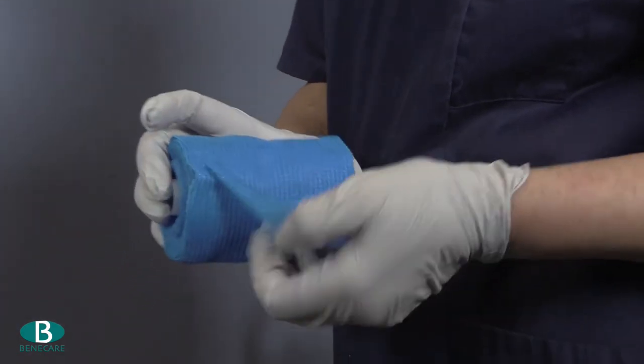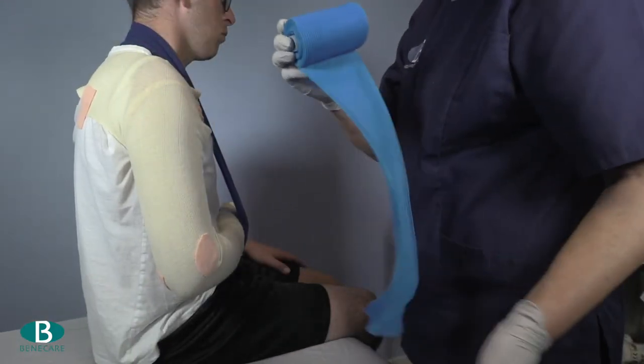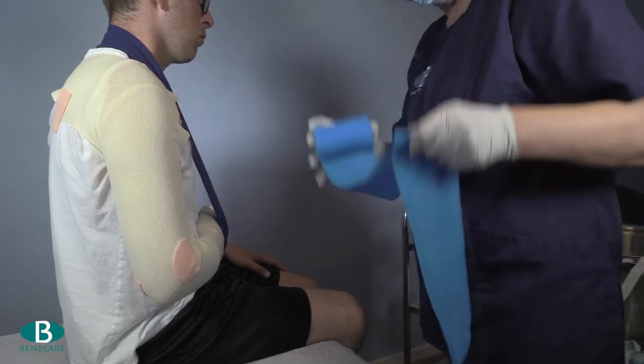Now apply your gloves and using the Benicast Advanced 4-inch, make a two-layer slab fitting from the elbow to the shoulder.